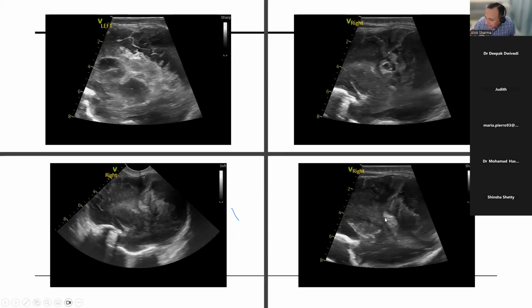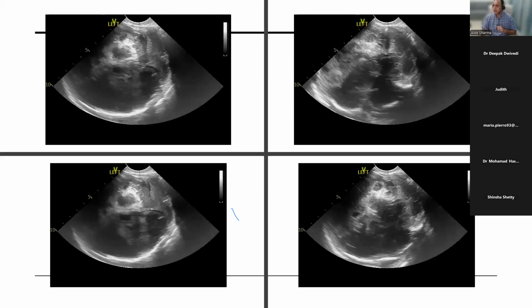And you have an element of infarction. So I don't quite have a walled-off lesion, as Maria was rightly mentioning, but what I've got is basically brain that's undergone complete necrosis, kind of complete cystic encephalomalacia. So, prognostically not great. And this basically is which view?